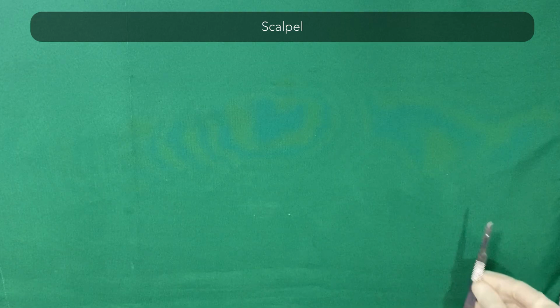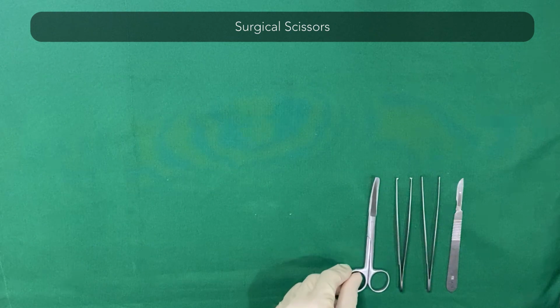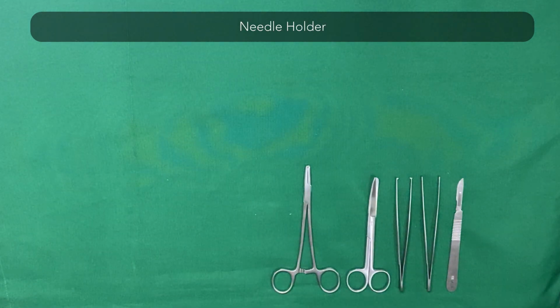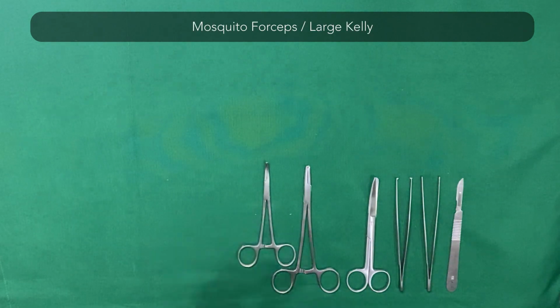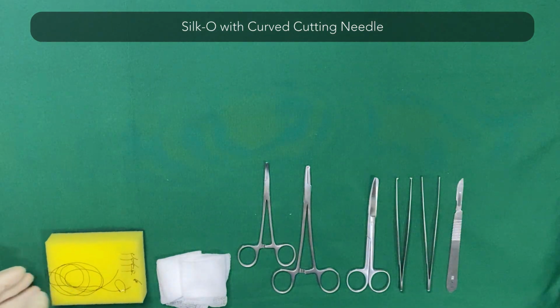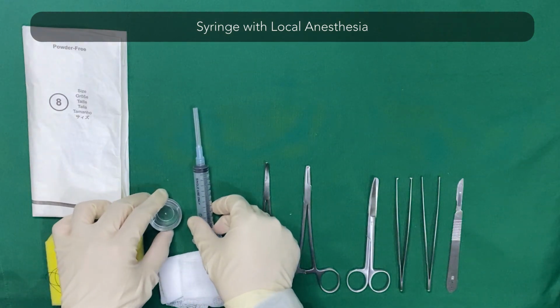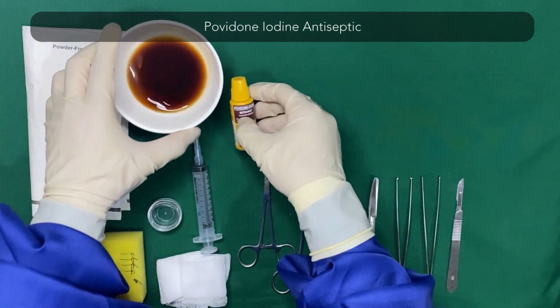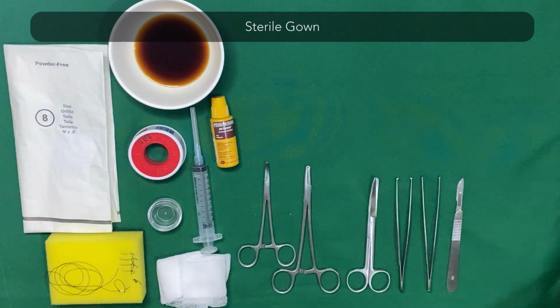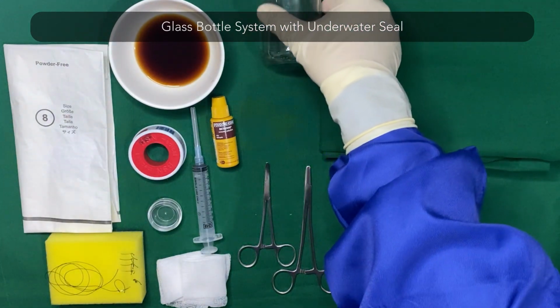Materials needed: scalpel, forceps, surgical scissors, needle holder, mosquito forceps or large Kelly, Vaselinized gauze, silk O with curved cutting needles, sterile gloves, syringe with local anesthesia, povidone iodine antiseptic, plaster, sterile gown, glass bottle system with underwater seal, chest tube.